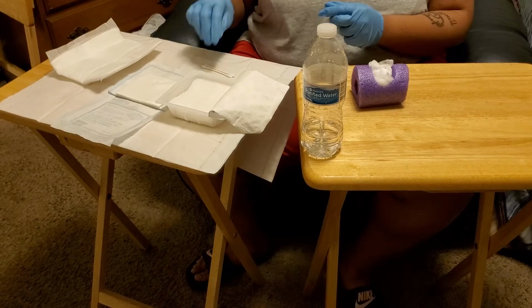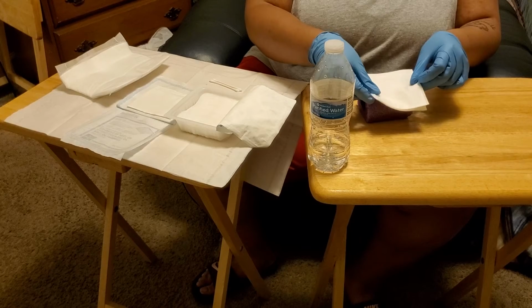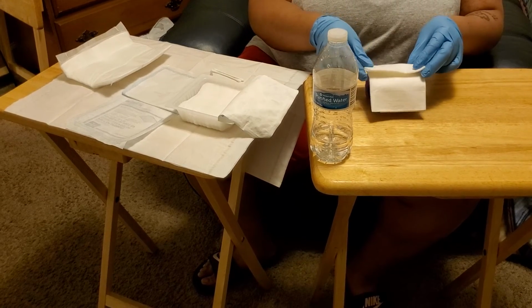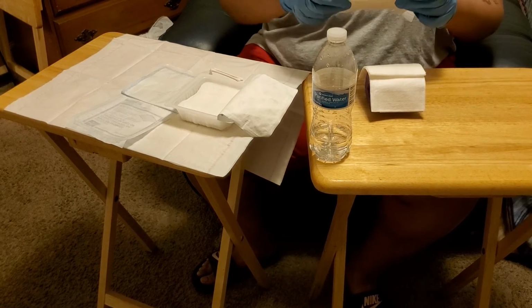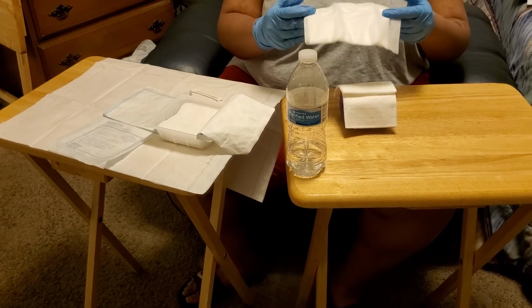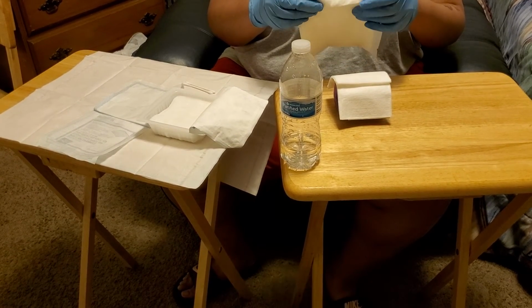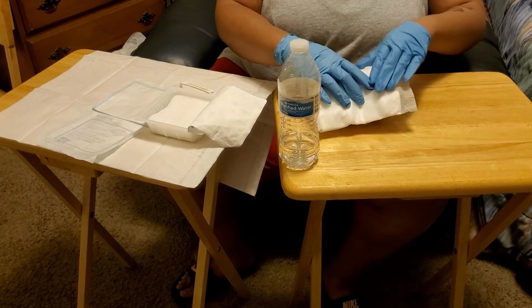Right? So now that we have that, we would take our 4x4 gauze, so we place one here, and we place the other here, and then on top of that we place our abdominal pad. And so the blue line is always facing up to the sky, so that's here, right? And oftentimes, we can't cut this because it defeats the purpose, but we can fold it, right? But for this purpose I'm not going to, and we just place that on top.